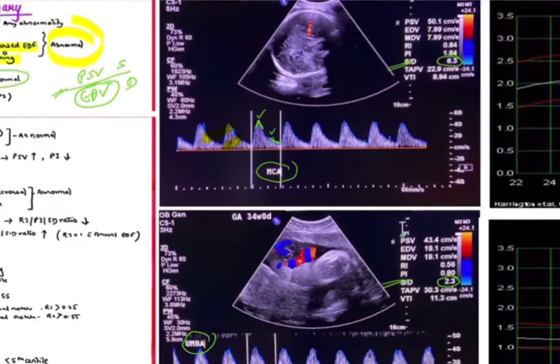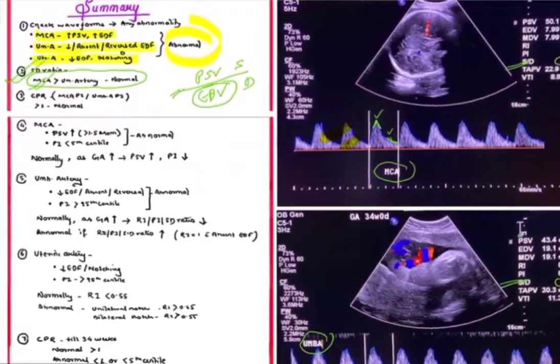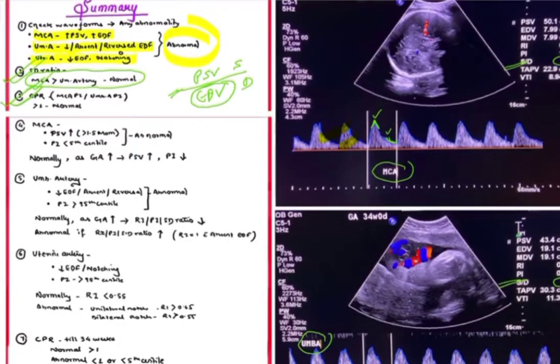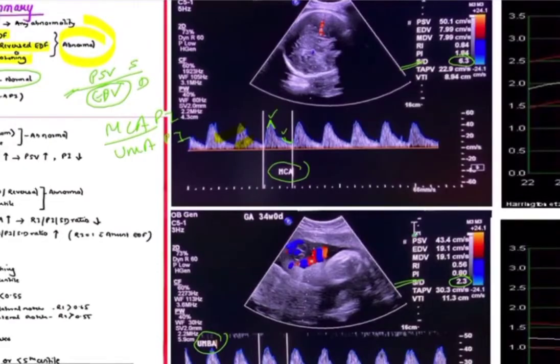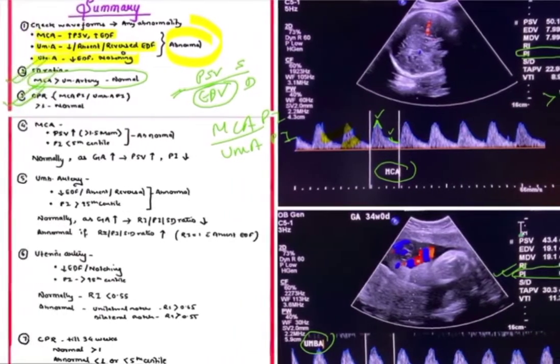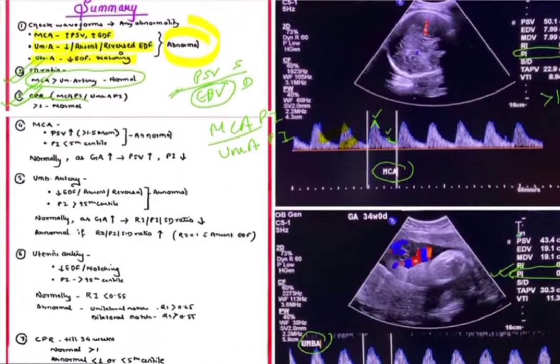Next in line is the CPR — the Cerebro Placental Ratio. CPR is the ratio of MCA PI upon umbilical artery PI. Here, the PI value of MCA is 1.84 and the PI value of the umbilical artery is 0.80. The PI ratio of MCA upon umbilical artery should be greater than one. In this case it is greater than one, so the CPR is absolutely normal.